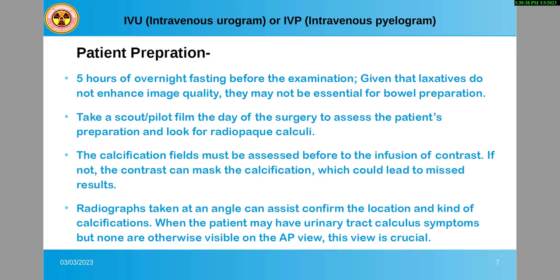The calcification fields must be assessed before the infusion of contrast. If not, the contrast can mask the calcification, which could lead to missed results. Radiographs taken at an angle can assist confirm the location and kind of calcifications.